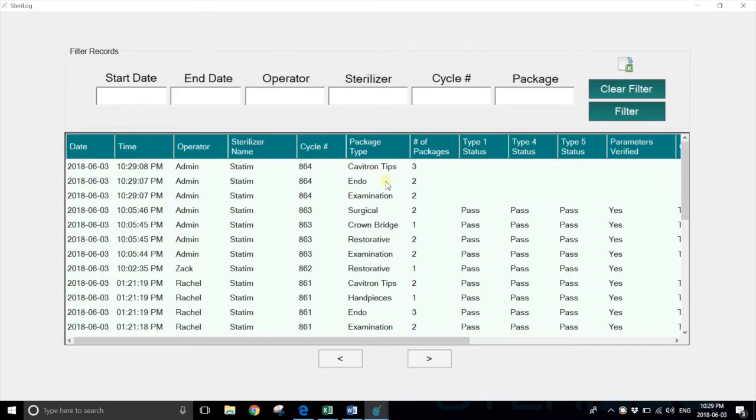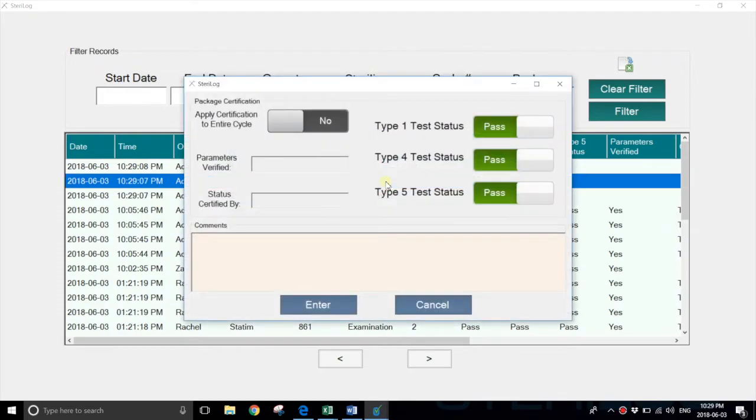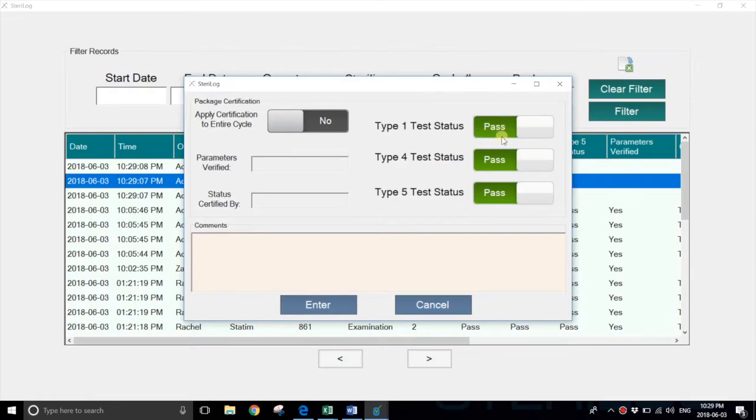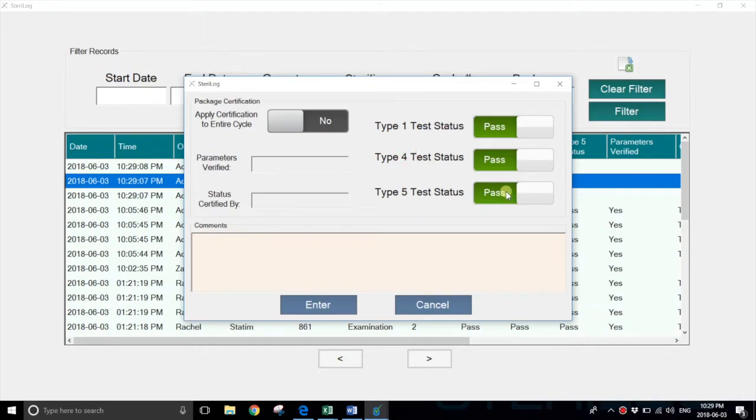She could select any one of them and sign off on the chemical indicators. You have your Type 1, Type 4, and Type 5 indicators. If these are all passed, you set them as such.